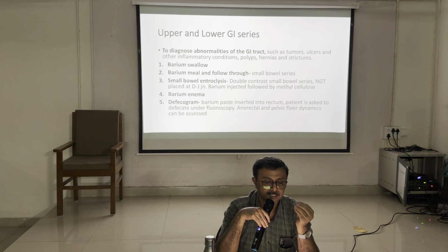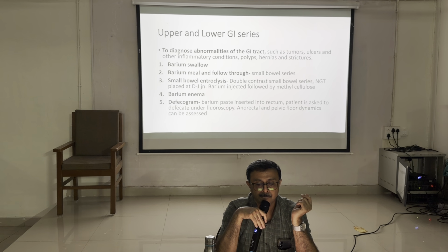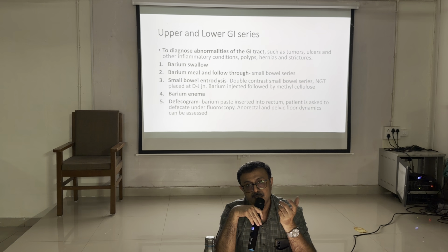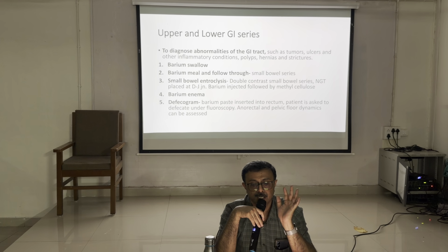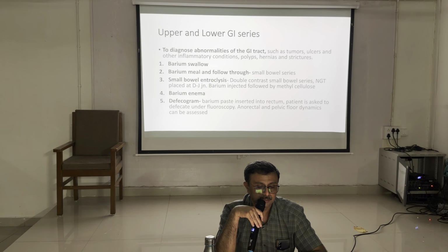So what is upper GI series? Barium swallow, barium meal, barium follow-through, small bowel enteroclysis. Lower GI series is barium enema. So what is the purpose? It is just opacifying the lumen with barium so that it gives you detail of the mucosa, and space-occupying lesions or even obstructive lesions. You can identify tumors, inflammatory conditions, polyps, hernias, and strictures by these studies.